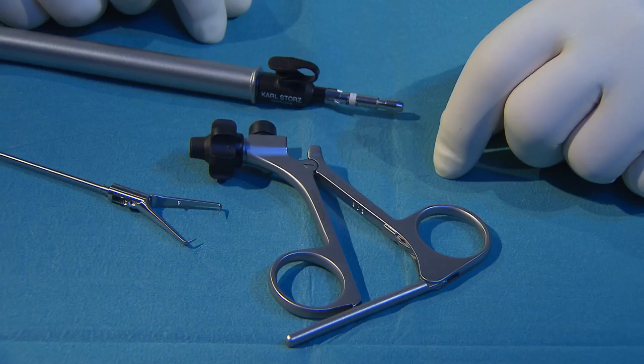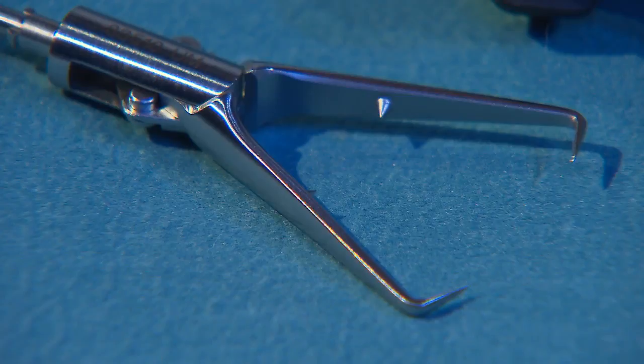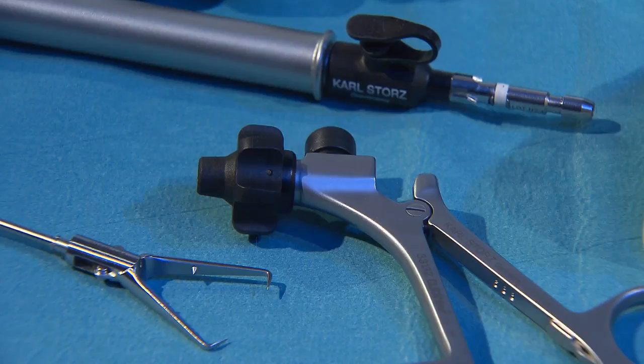For optimal cleaning, the forceps can be separated into three parts: insert, outer sheath, and handle. 10mm and 15mm tissue grasping forceps are also available.